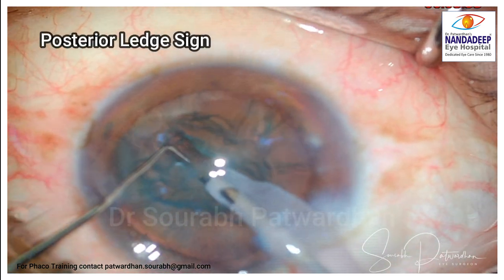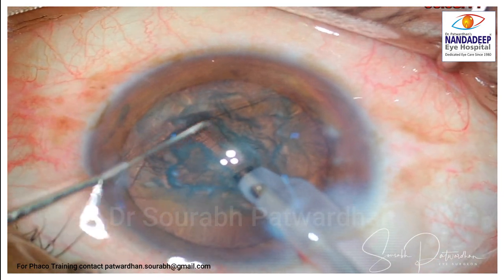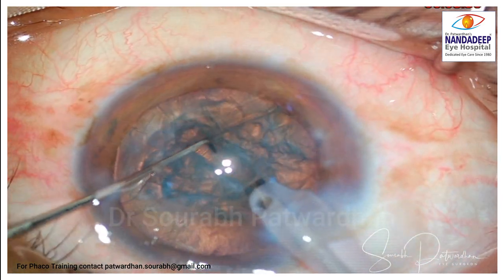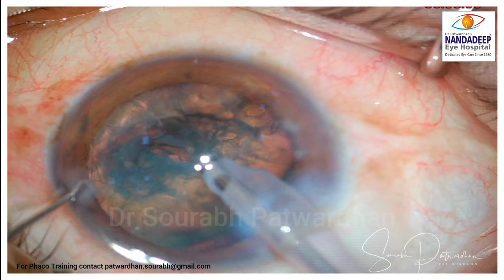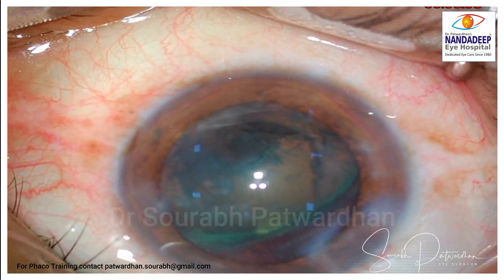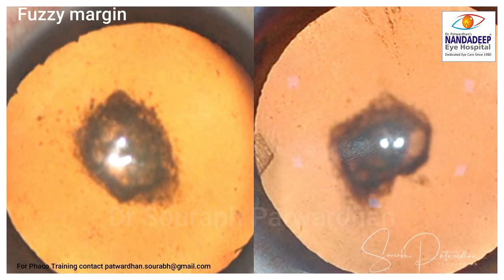The posterior capsule opened up during hydro dissection. Now you can see the classical posterior ledge sign which I have described — the posterior capsule and posterior cortical matter seen like a ledge — and the nucleus is actually in an impending drop situation, going downwards posteriorly. The ledge sign was not picked up by the surgeon, and that is why you can see the nucleus slowly tilting and going into the vitreous. So definitely, there was a posterior capsule opening during hydro dissection.